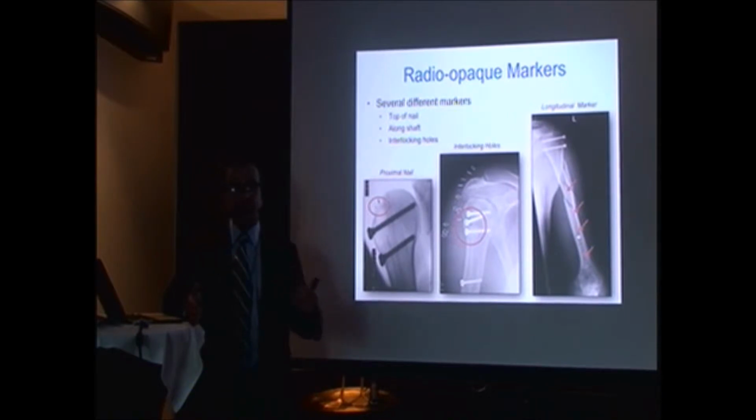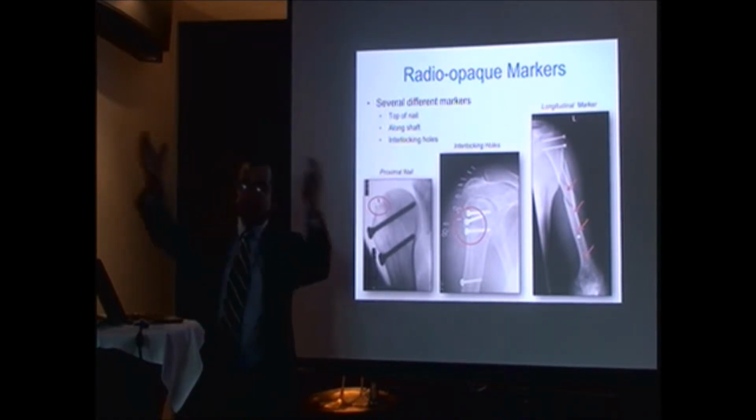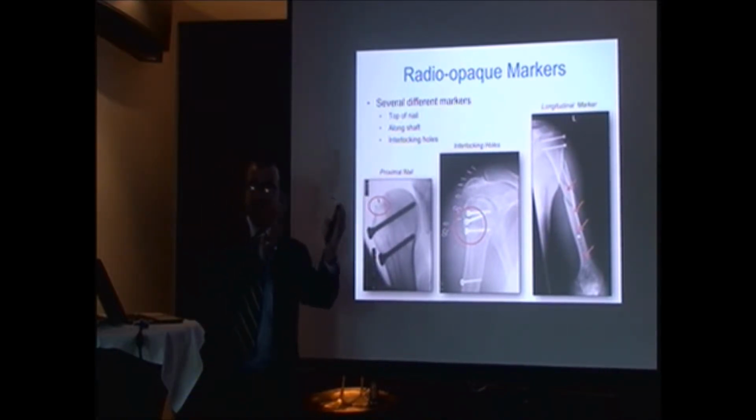It can take somebody who's not an expert 20 minutes to just put one screw across the holes. Are there any surgeons in the room? Any orthopedic surgeons? Anybody sales? When you see the surgeons in the community trying to put in the screws, there's a big spectrum of quality. You have the good surgeons, they can do it very quickly. And then you have other surgeons, you just think, what is so hard about putting a screw in a little hole? And it takes forever.